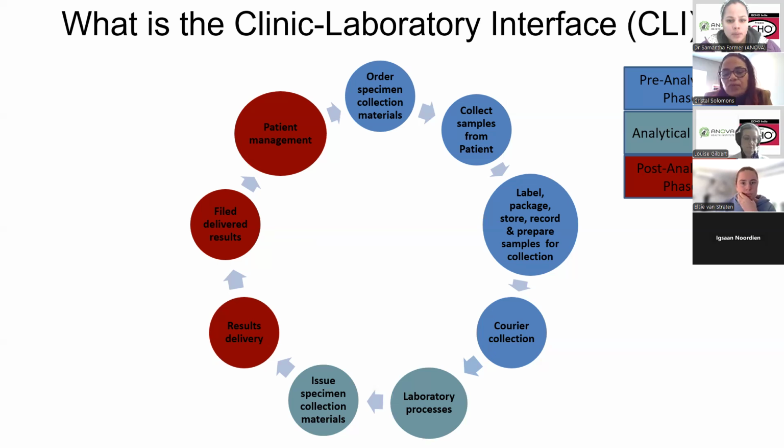And then the courier will come and collect the sample, then it goes to your analytical phase that specifically looks at lab processes. And then the post-analytical phase is around the actual management of the results. So you will see there's a result delivery to the facility, then it gets filed, and then the patient management.